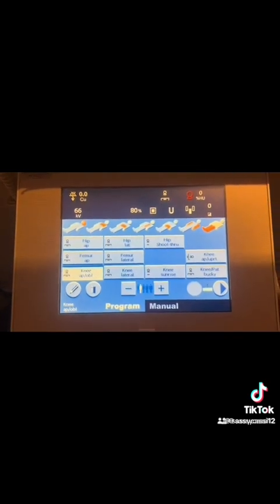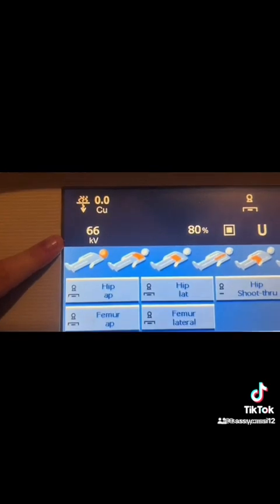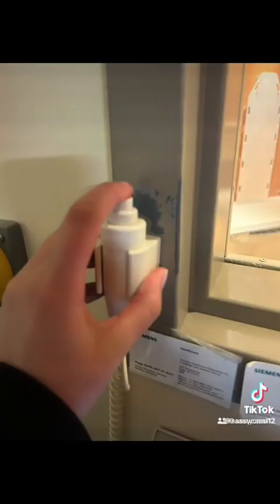Since we are using a center chamber AEC, it tells us that the exposure will terminate when the center chamber has been fully activated. There are no breathing instructions for an AP knee, but I just informed the patient to hold still. The exposure factors for an AP knee are around 60 to 70 kVp and 7 to 10 mAs.